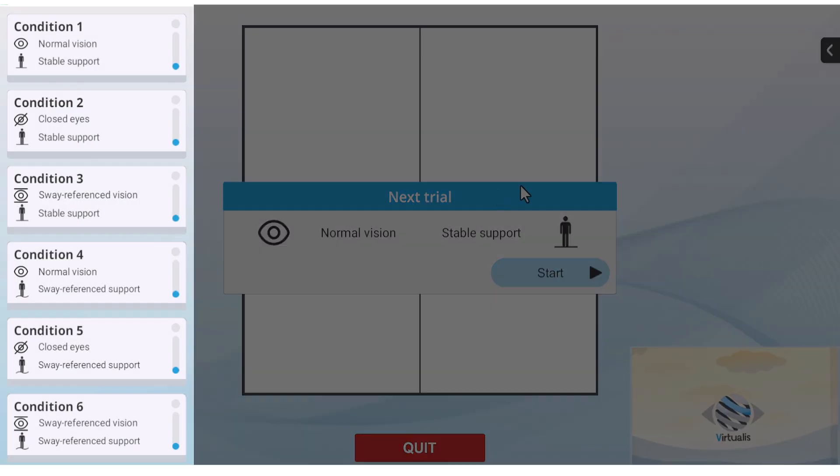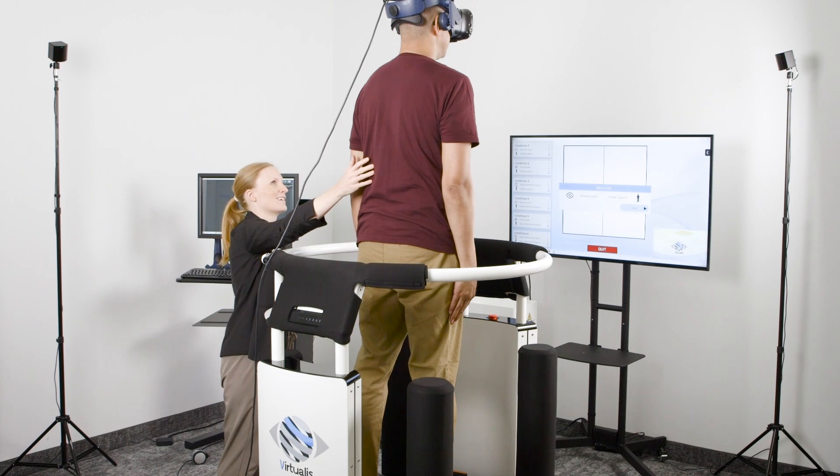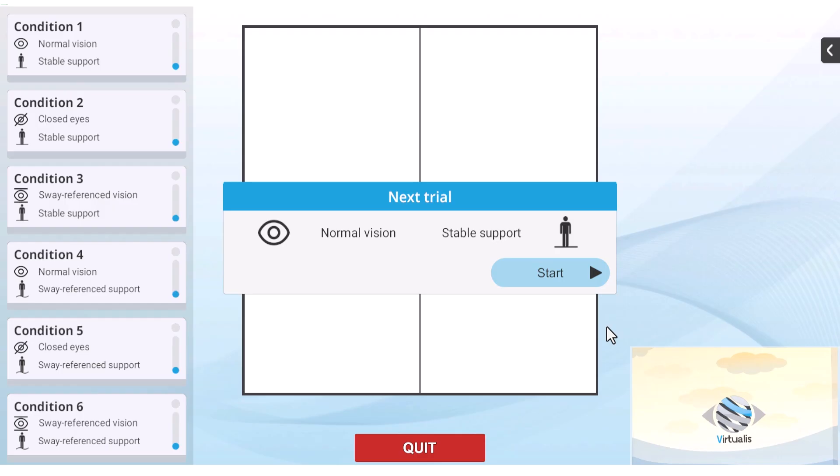Here are the six conditions of the sensory organization test. Once you launch the test, the platform will ascend to the starting test position. You are now ready to begin the assessment.